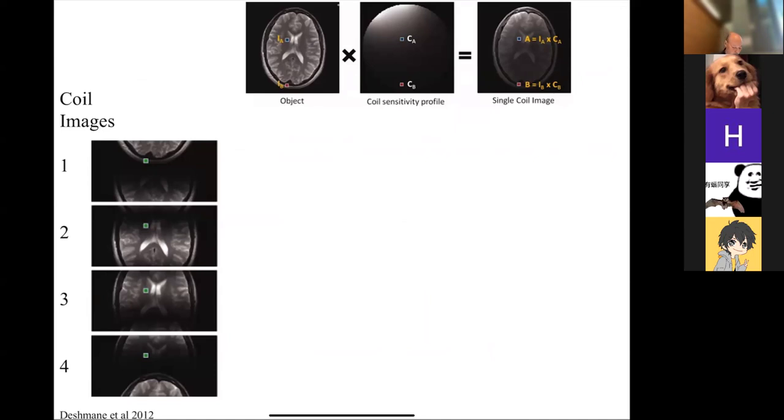Okay. So here's the fundamental picture we want to look at. On the left-hand side, I have 4 images, and each of them is aliased. This one is obvious to see, but the other ones are aliased as well. Here, you can see this is coming into here.